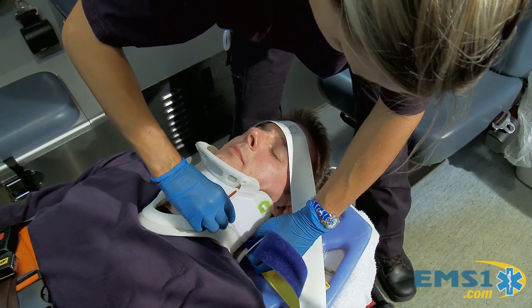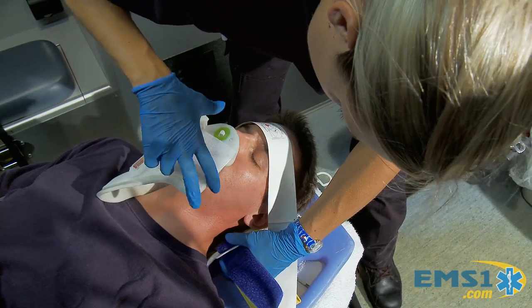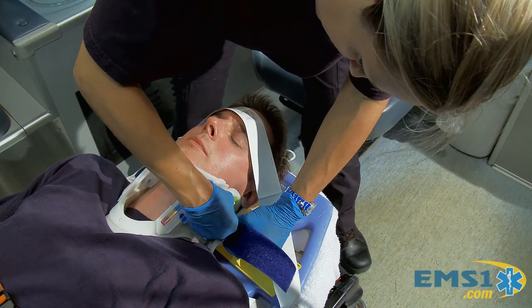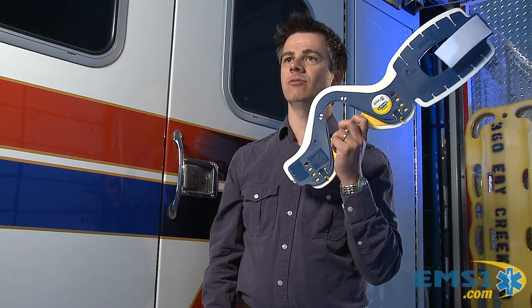You can go clear, you can go opaque. With the opaque one, it presents a few problems. You have to open it up, check underneath it, see if the patient's JVD is getting worse, if the wound is not closing off and you haven't stopped the bleeding. You also present a problem because you're always moving the patient's neck when this happens, and then you have to reassess the neuros — make sure they can move all their limbs after you do it. So you're taking time away from treating the patient while you're using this.